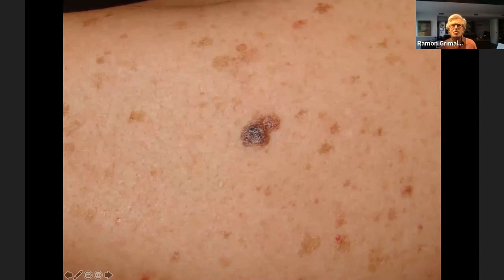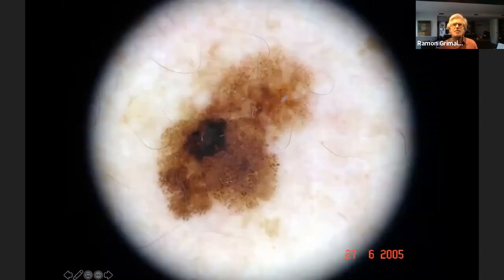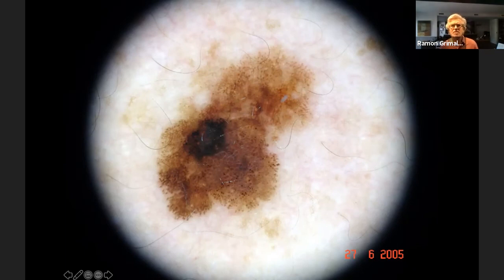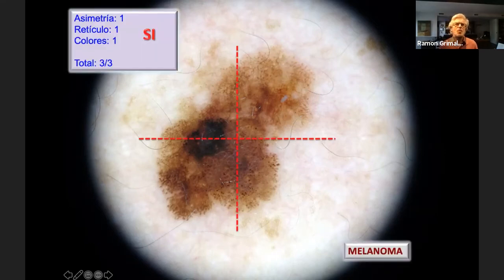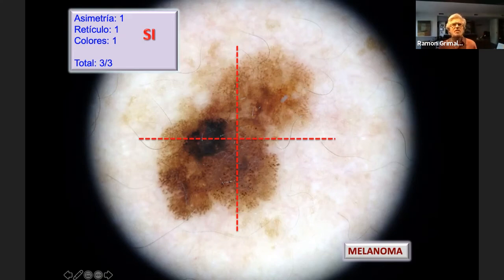Another case on a very solar-exposed child: thinking through the three-point list — is it asymmetrical? Yes. Does it have a strange pattern of network? Yes. Do you see strange colors? Yes, all three are present. It was clearly asymmetrical, with a black dot located on the left of the lesion, different patterns at the top and bottom, and this whitish and bluish coloration — meeting all three points for removal.